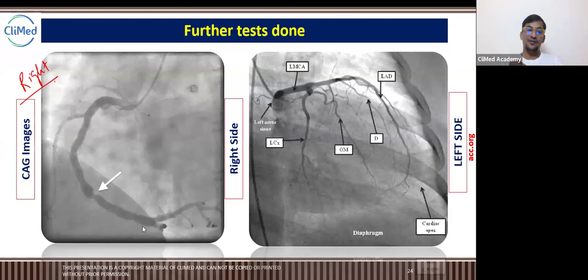Catheter. Okay, the wire is called a catheter. Eisenmenger syndrome I'll also tell. So when the catheter is passed from here, it goes to the aorta, and then to the coronary arteries, and we put the dye there. Based on the dye, we look at the screen to see where the exact problem is.